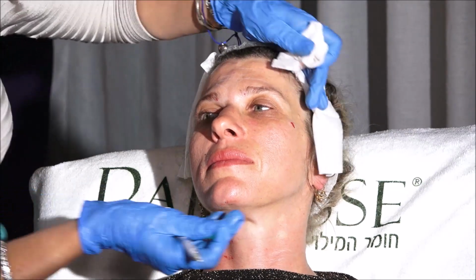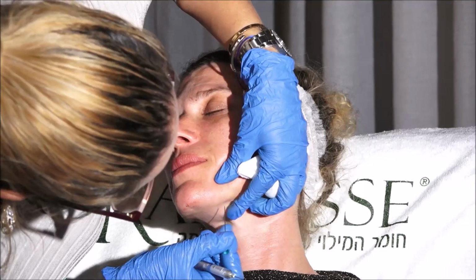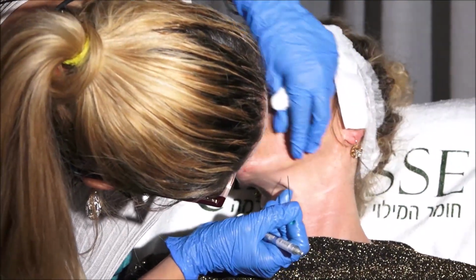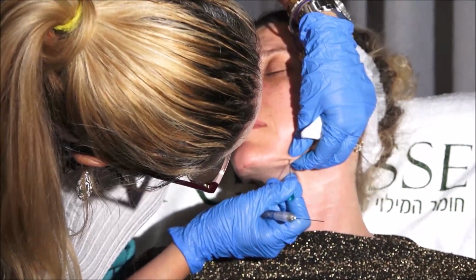5. And Radiesse Volume Plus, this one, right? Yeah, this is the plus. Okay. This is the long one, yeah. And if you have any questions, please just ask while I'm treating her.